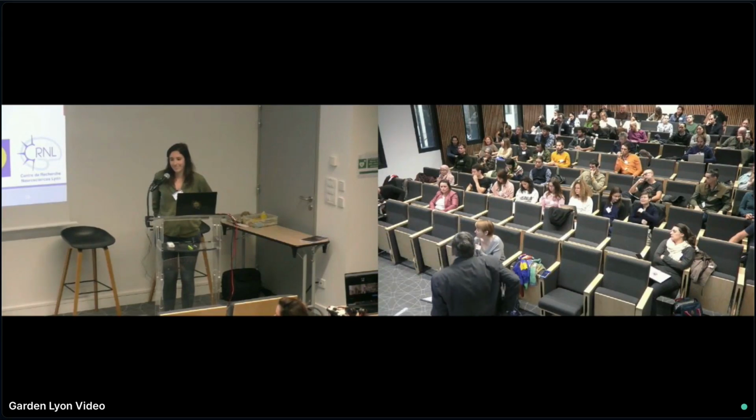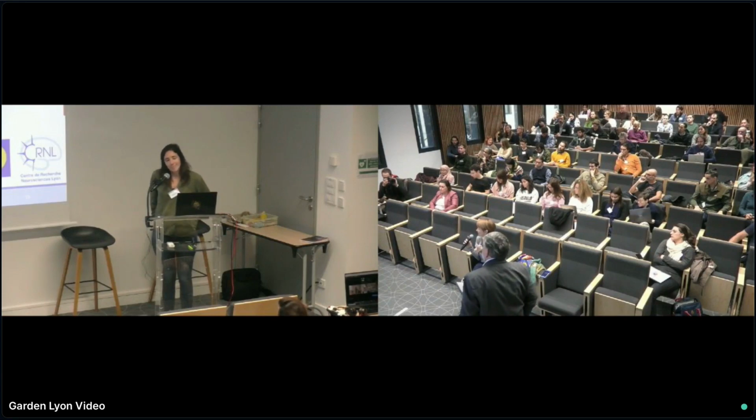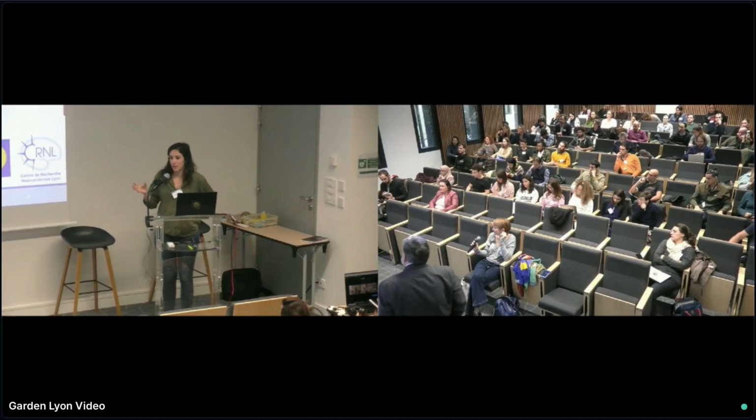The form of the spike depends on the type of epilepsy, and you could separate the groups. I'm not an expert in epilepsy and spikes and all that. I don't think the shape of the spike really depends on the type of epilepsy. I think it's more the localization, so on which sensor you're going to see it, if you have temporal epilepsy or, yeah.